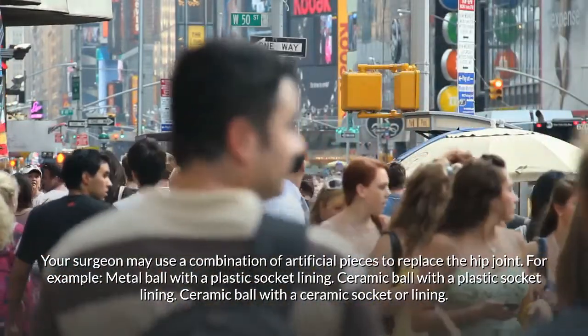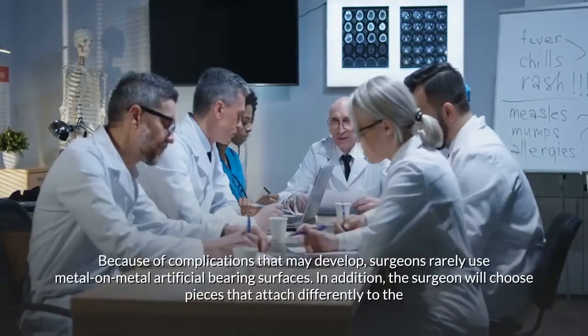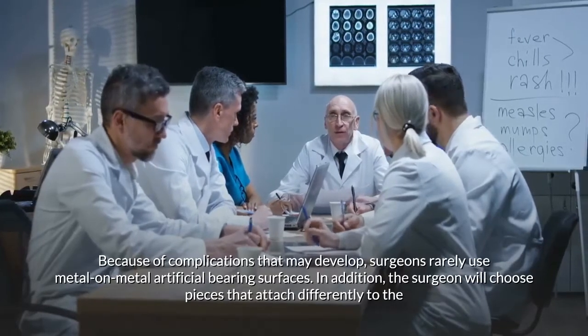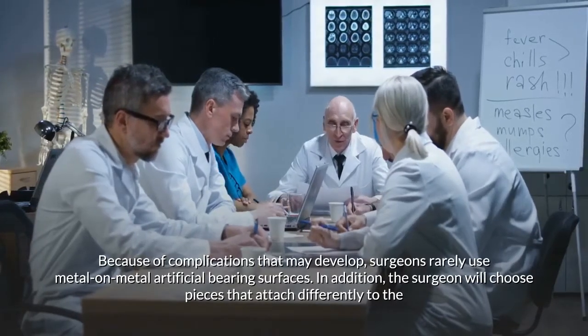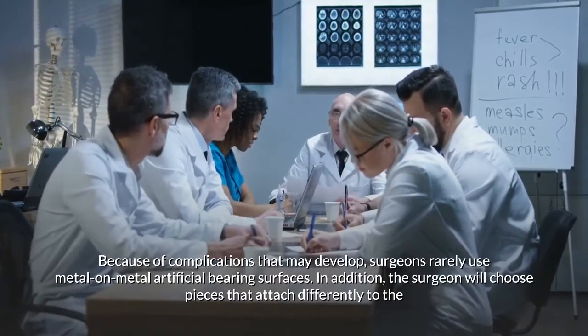Other options include a ceramic ball with a ceramic socket or lining. Because of complications that may develop, surgeons rarely use metal-on-metal artificial bearing surfaces. The surgeon will also choose pieces that attach differently to the remaining bone.